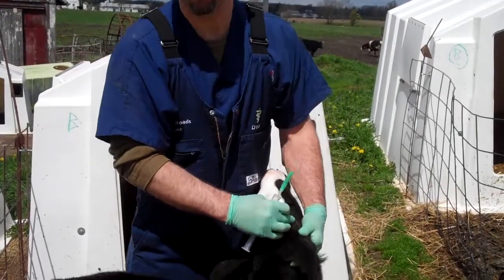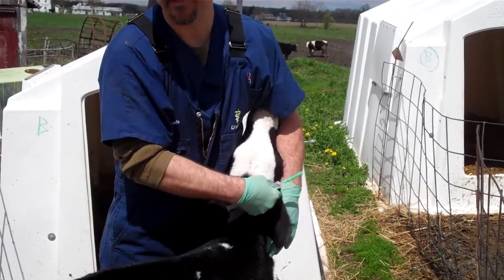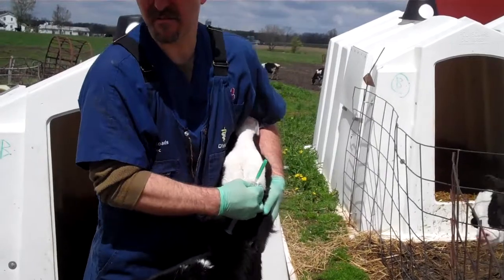You block the nerve that feeds the horn so they don't feel it when you apply the iron that prevents the horn from growing. This calf is about four weeks old and the horn is just barely — you can just barely feel it.